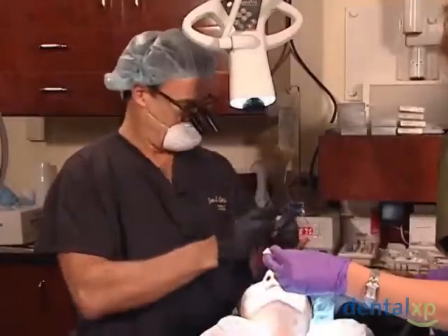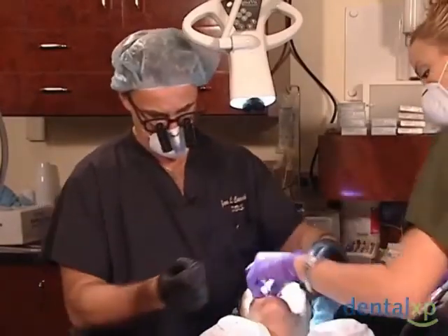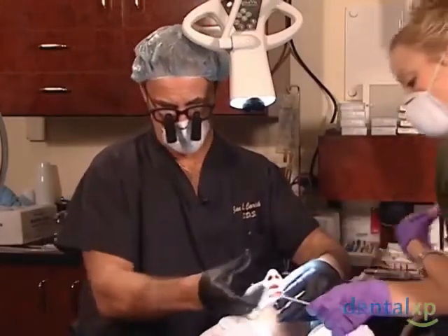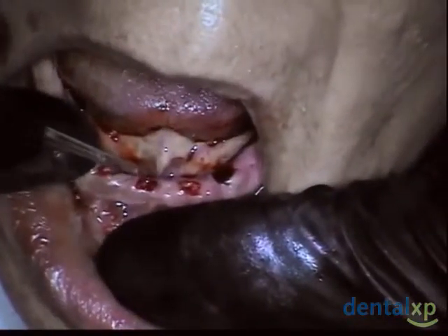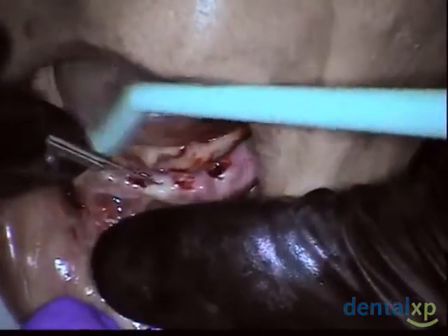So we'll use our tissue punch in just a second, but right now I'm going to make the incision. We have a laser. You can use the laser, or you can actually use whatever you normally use. The laser makes it easier, but for purposes here, I'm just going to make this incision mid-crestal.